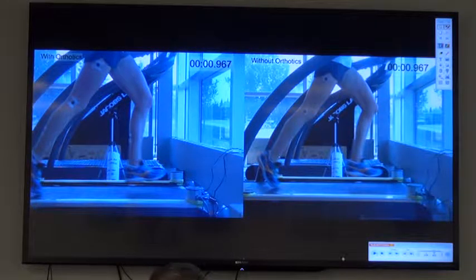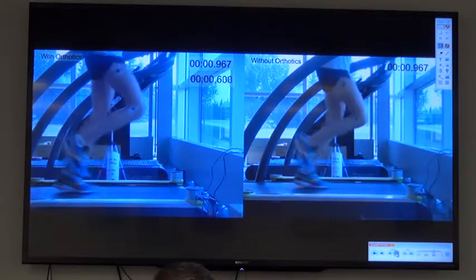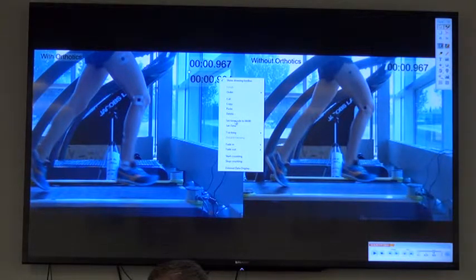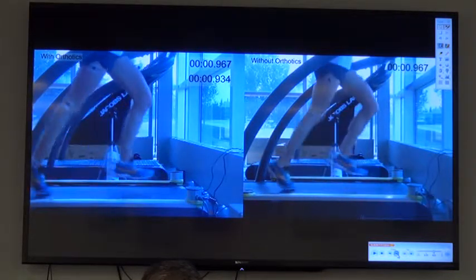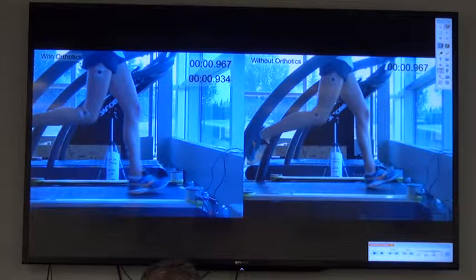So that would be the right foot. And then I would do the same thing on the left foot to see what her contact time is. So go back here, first contact, clock on here, 0 point. Watch her contact time on her left, which is there, okay? So stop counting, so a little bit less on her left foot by about 0.03 seconds. And then similarly, I would do the same thing on her left foot. Here, just look at the contact time. Right there, first contact, 0 point.